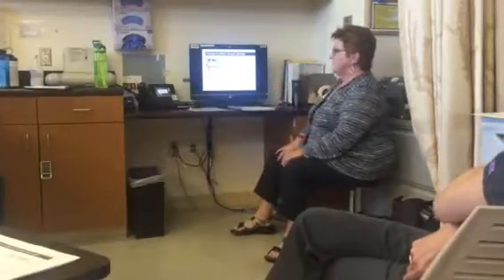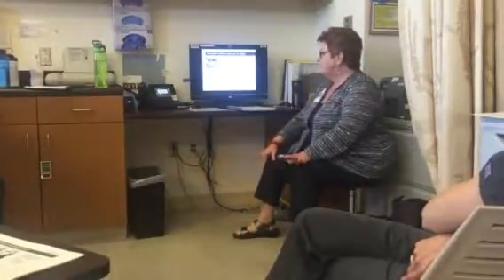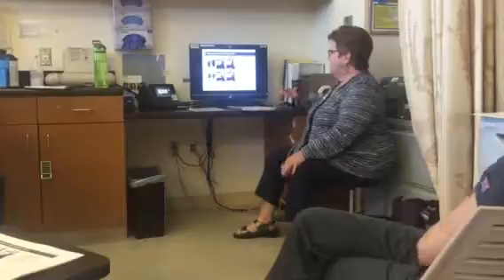Next one is the reverse collection line. The collect port, the collect line looks too dark. What are you gonna do? Increasing. Very good. Simple as that.